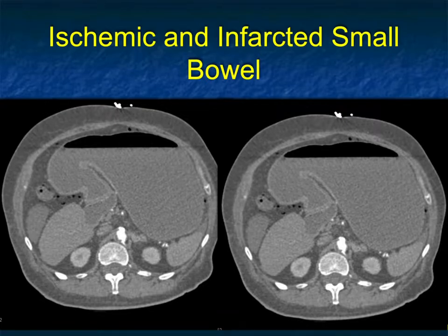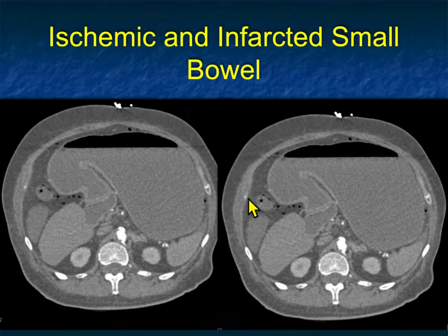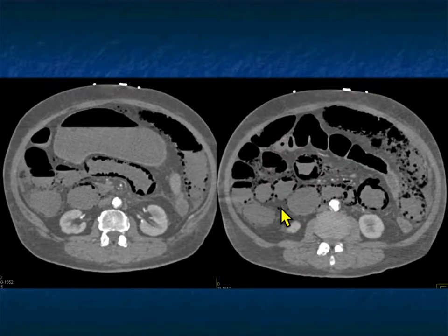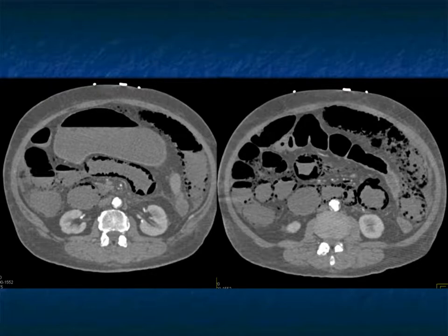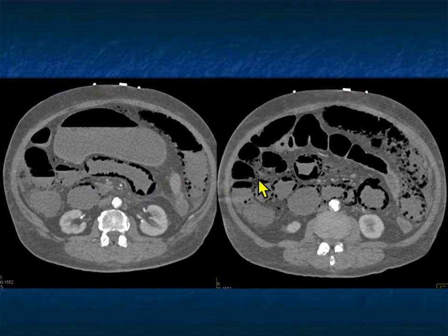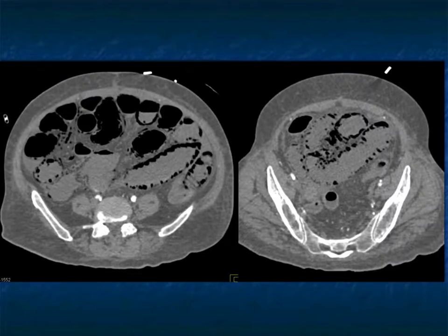Here you see a dilated stomach and duodenum, then air bubbles in loops of bowel more distally — this is pneumatosis of the small bowel, ischemic and infarcted small bowel. That's a dramatic appearance. The chance of this patient surviving is very low because even going directly to surgery, there's extensive infarcted bowel requiring extensive surgery. Look how small the mesenteric vessels are — unfortunately this patient will die because of infarcted bowel due to ischemia.